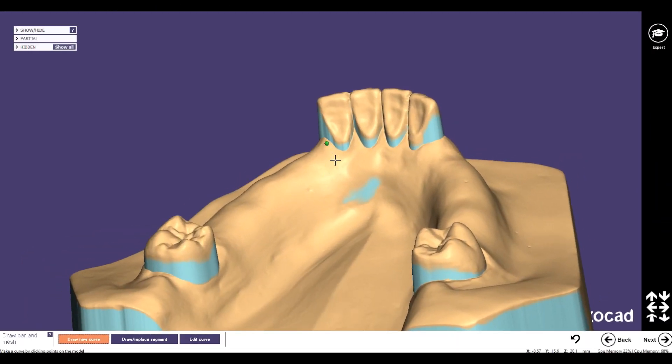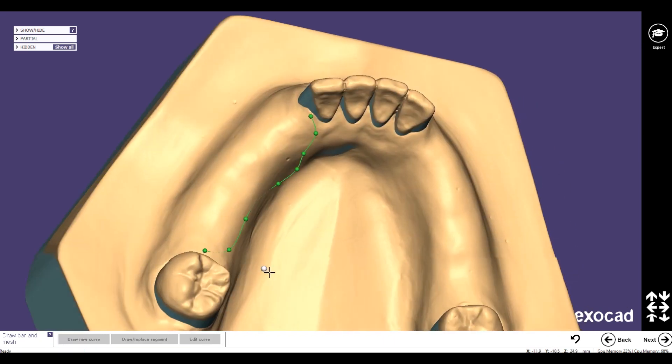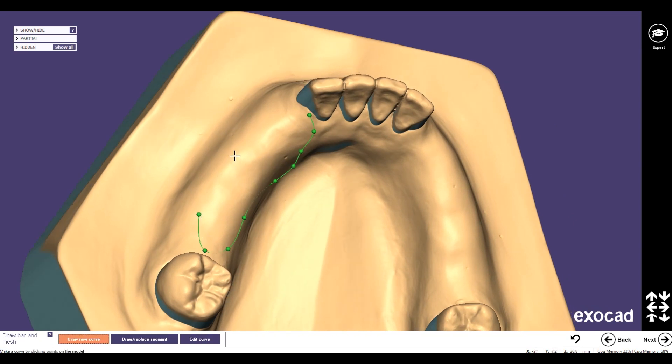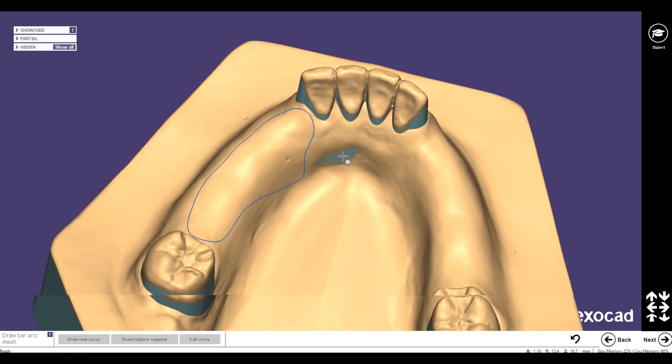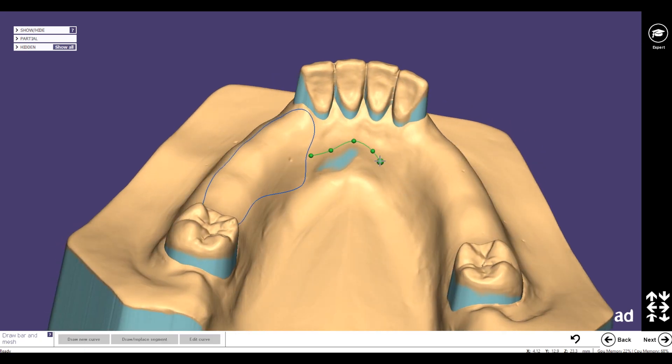Hello and welcome. In this video I would like to introduce you to how you can place retentions for the lower jaw that look really similar to the retentions we have in the classical way. Not everybody likes the retentions which are available in Exocut, and the workflow is also a little bit complicated.